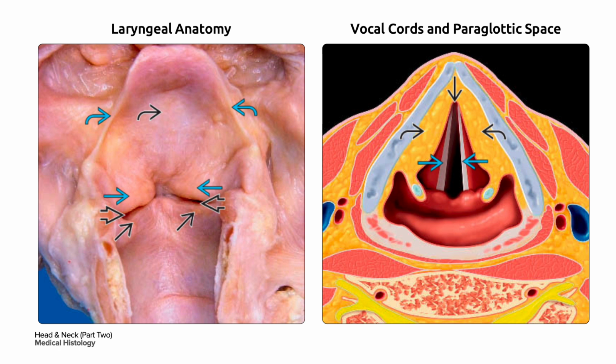On your left is a glottis containing the true vocal cords in single black arrow, which are just below the ventricles in bold black arrow. The supraglottis is also composed of the epiglottis in curved black arrow, false vocal cords in single blue arrow, and aryepiglottic folds in curved blue arrow.